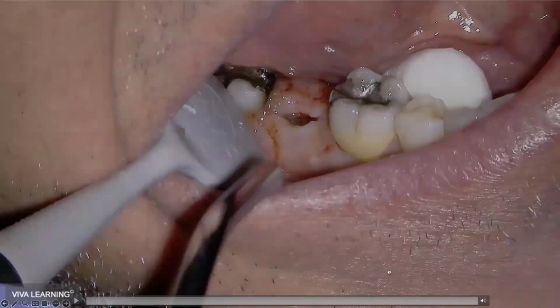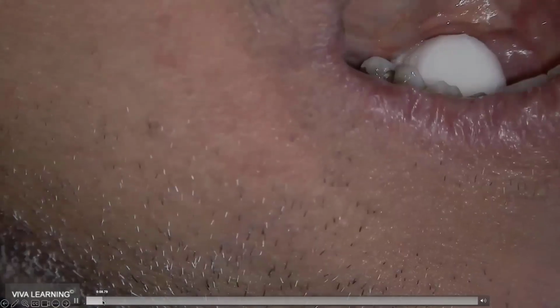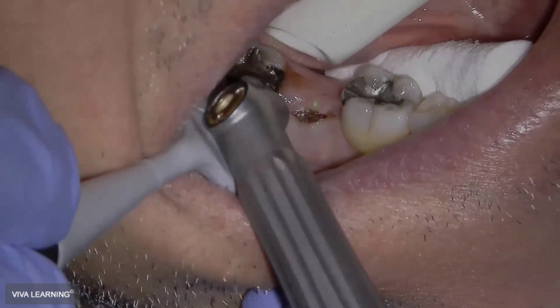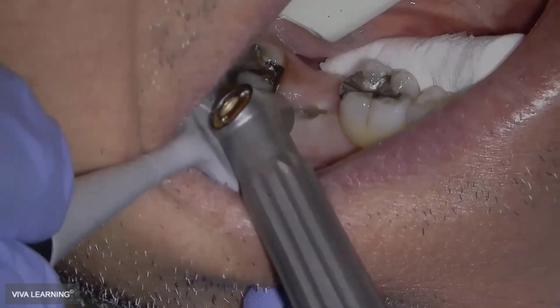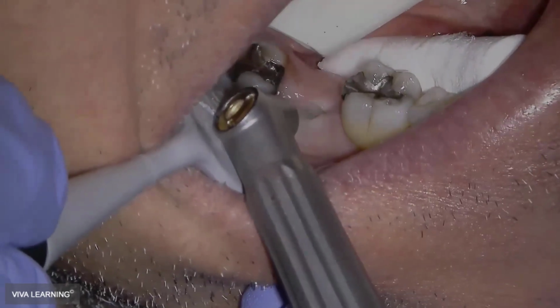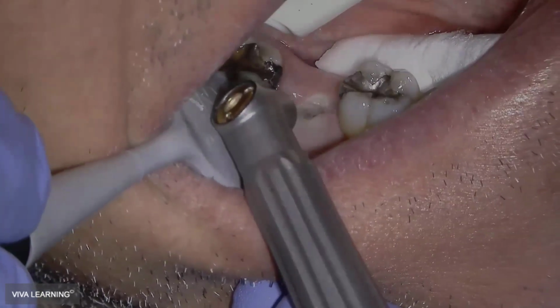Now, in this case, this is a case I had where this patient comes back after a two-stage implant, and I'm going to skip forward through this just for time because we're getting to the end of our hour here, but this is actually a 6.5 millimeter diameter abutment that is buried.